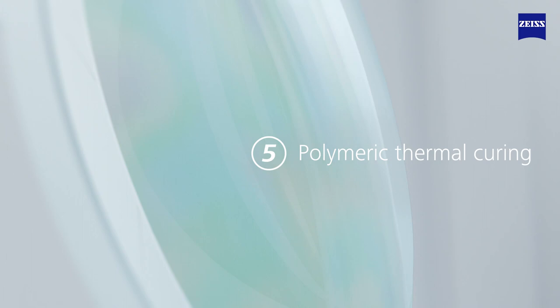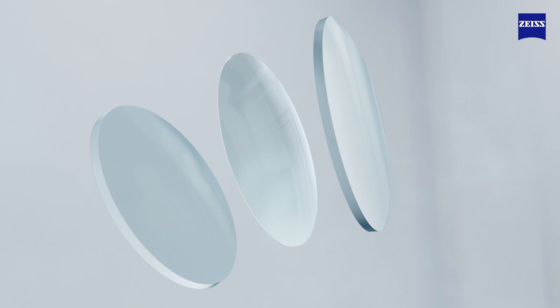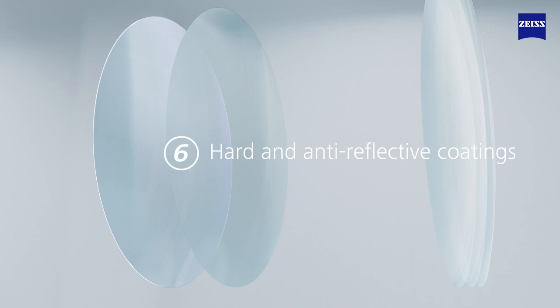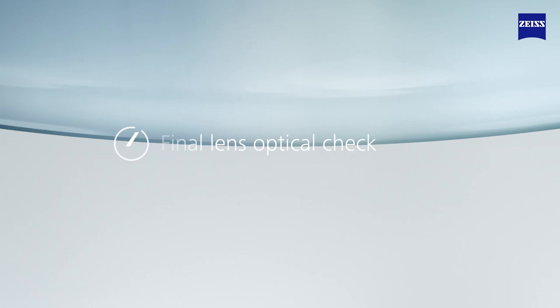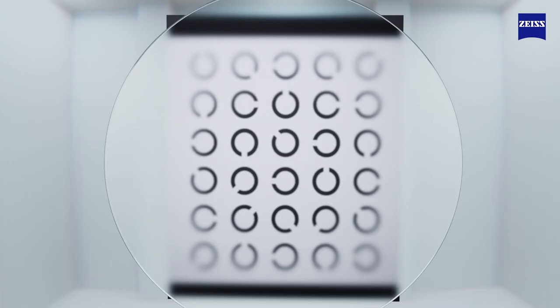Once the curing process is complete and the lens material has cooled down, the glass molds are removed and the result is a Zeiss Clearview lens. The casting and curing is followed by a tough and abrasion-resistant hard coat and Zeiss DuraVision anti-reflective coating process. Finally, the precise lens surface geometries are checked once more and tested in the Zeiss optical ray path simulation to ensure the finished Zeiss Clearview lens delivers on its promise.